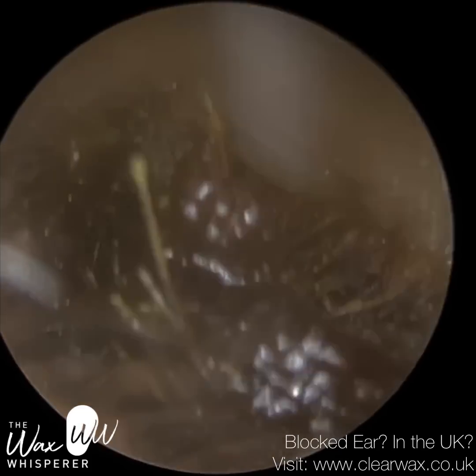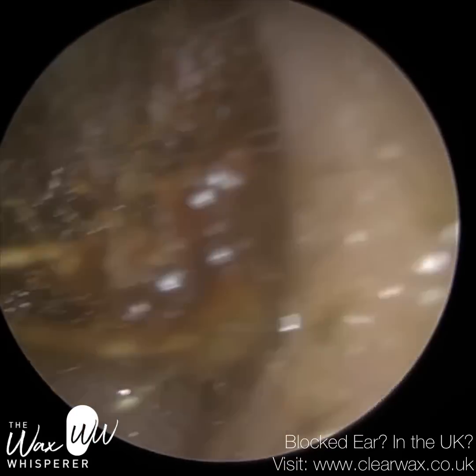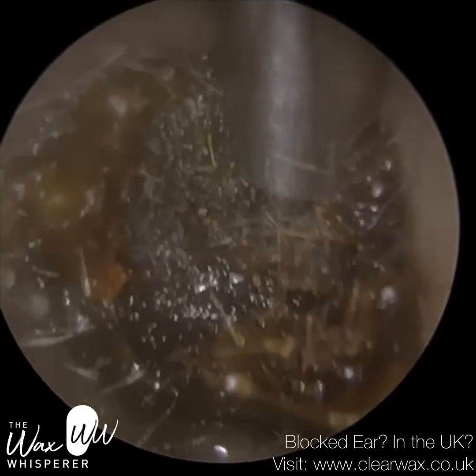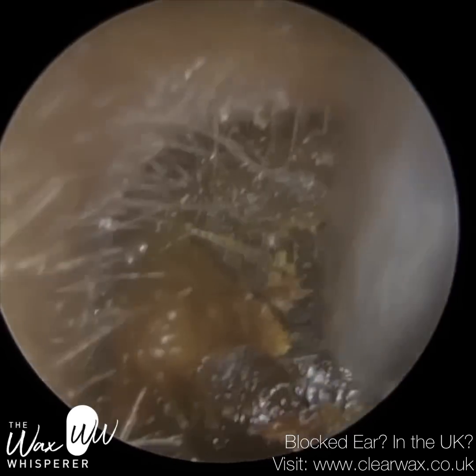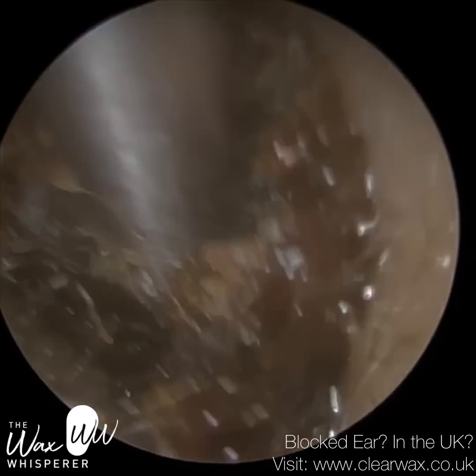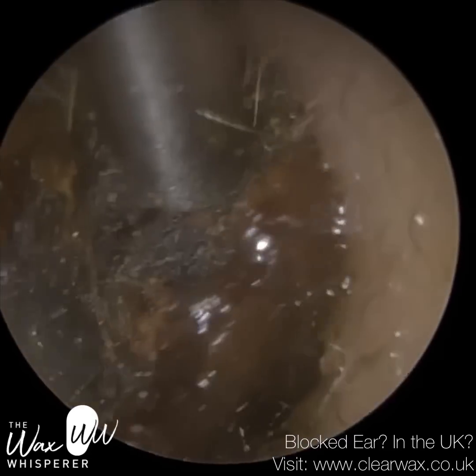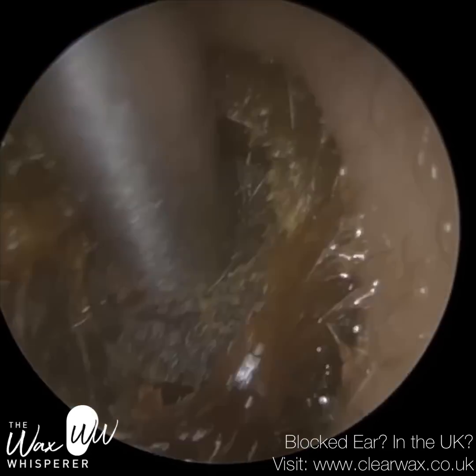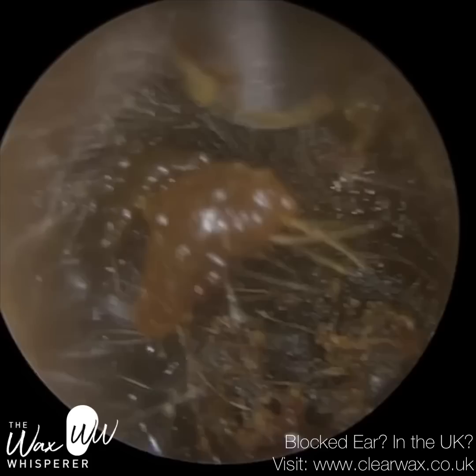So just moved on to their left ear, and ironically this ear was a bit more difficult to remove in some respects because the plug was larger than the entrance of the ear, and I'm just having to squeeze this through. So we brought it forwards. I'm just trying to wriggle it through here. It was a bit firmer because the patient didn't use any drops in this ear, as opposed to the right side where the wax was a lot softer, so it could come through a narrowing.